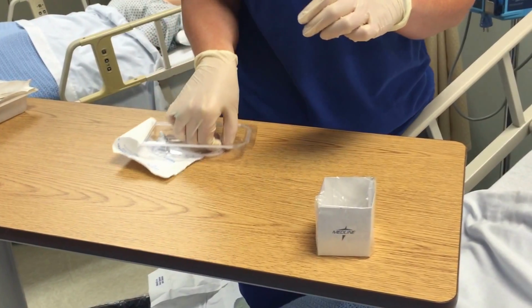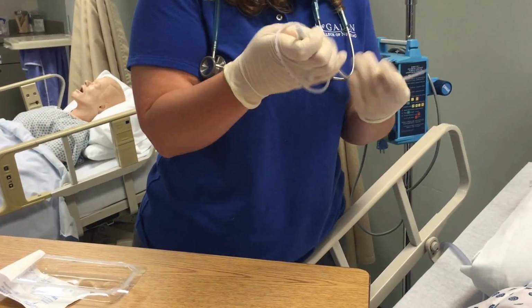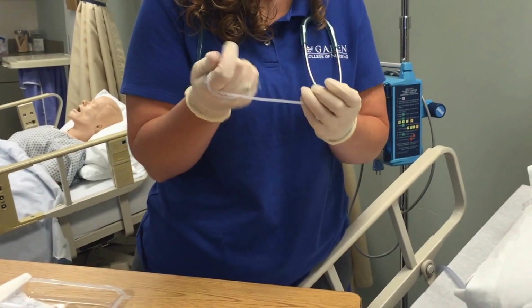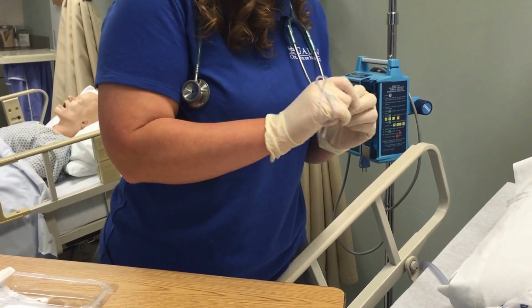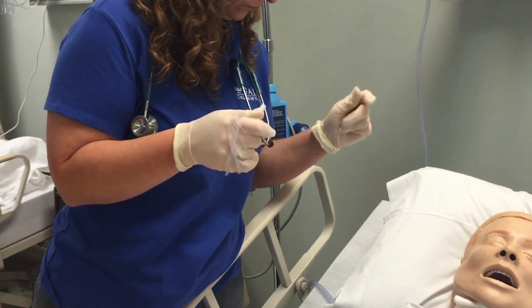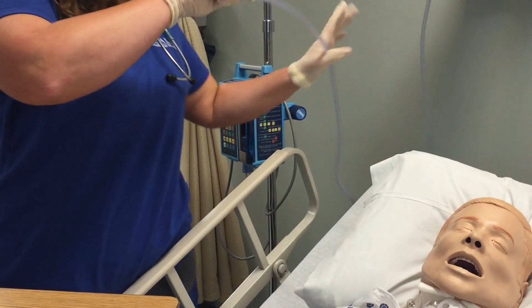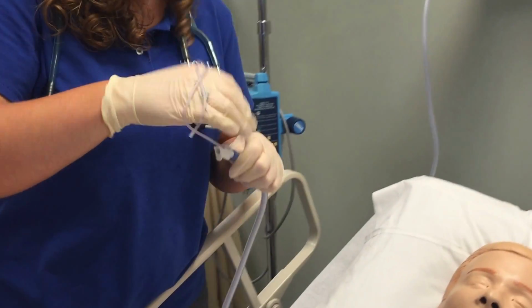Alright, so it's better if you want to go ahead and use both hands to pull out your tube so you can wind them both around your hand. And use that to manipulate and get it ready. Alright, so you're going to have, my left hand's going to be my dirty hand. And I'm going to go ahead and connect this to my tubing. Make sure it is still turned on and ready.